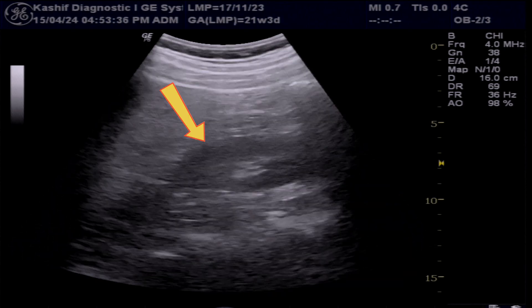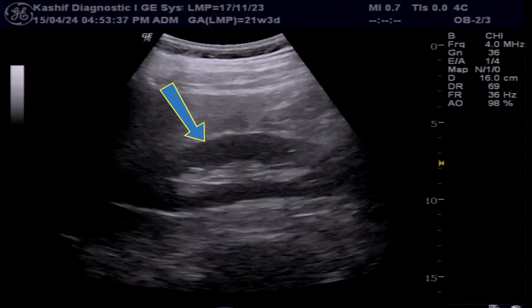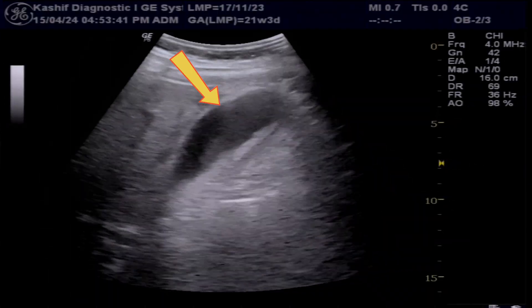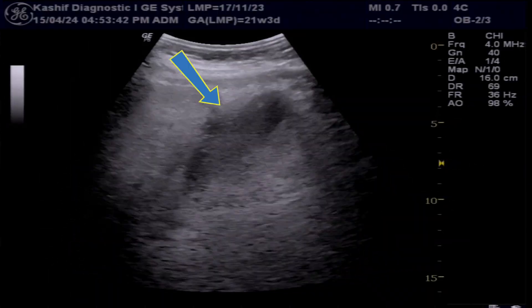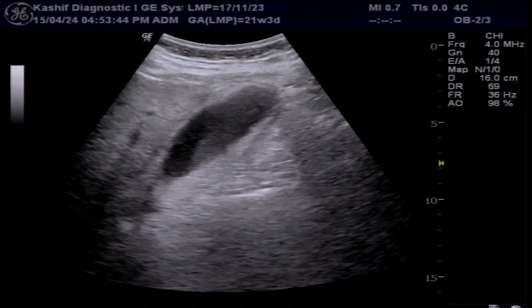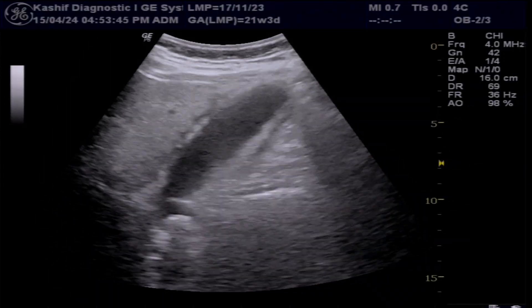The right kidney is normal. This is the gallbladder, and this is the site of the patient's pain.